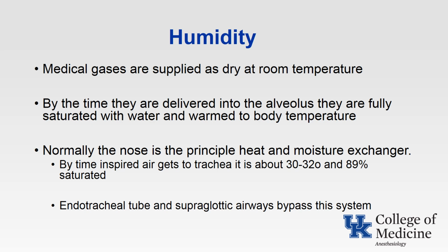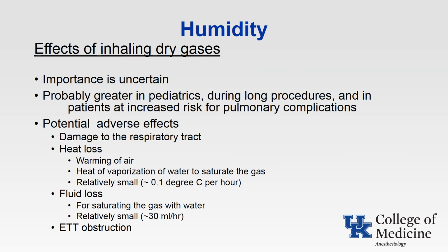Unfortunately, the endotracheal tube and supraglottic airways bypass the system. The effect of inhaling dry gases is uncertain. Probably it's greater in pediatrics, long duration procedures, and in patients at increased risk of pulmonary complications. Potential adverse effects include damage to the respiratory tract, heat loss, fluid loss, and endotracheal tube obstruction.